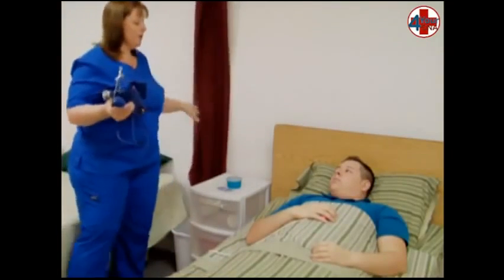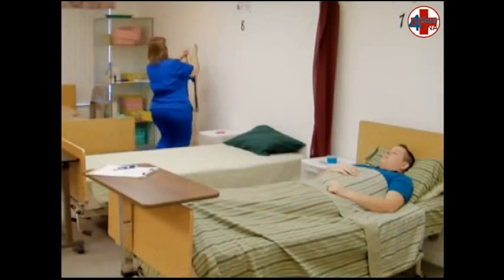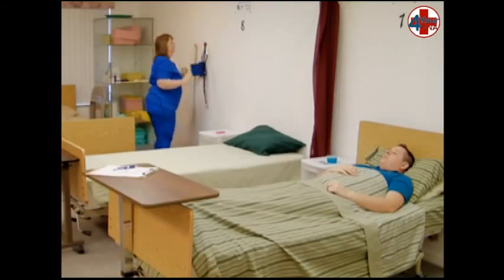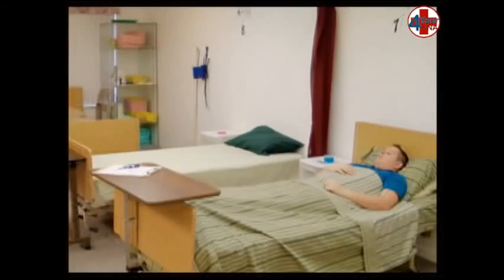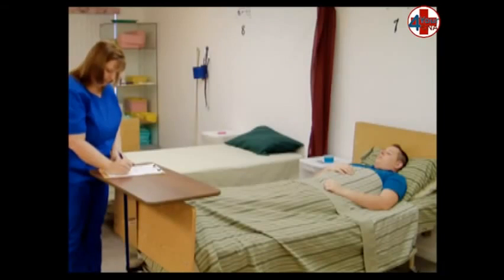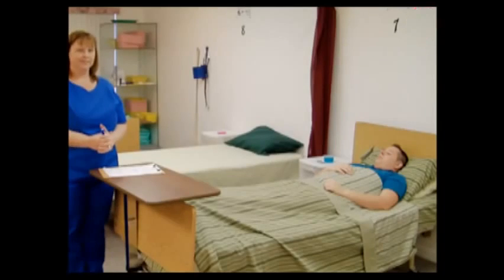Open the privacy curtain, making sure your patient has his call light, and return your equipment to its storage area. Wash your hands. When you return, document the patient's blood pressure on the documentation sheet by writing the larger number followed by a diagonal line and then the smaller number on the space provided for blood pressure. Review the steps of your skill and tell the evaluator, my skill is done.